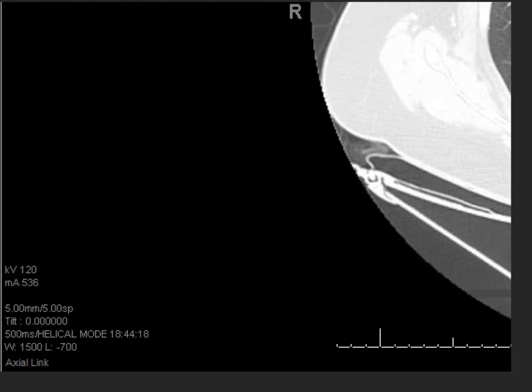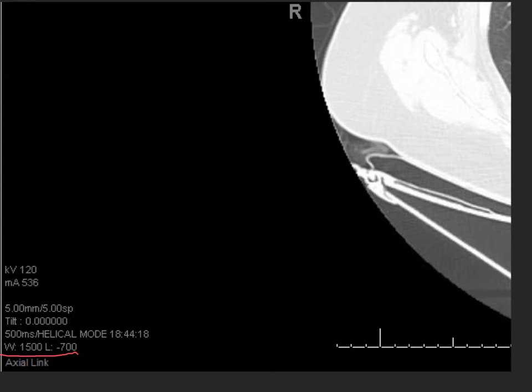Now I'll describe what I mean by a window and a level. Where can we find this information? If you look at the corner of any CT image, you will see a little W and an L. This particular CT scan has a window of 1500 and a level of minus 700. Any tissue window is a combination of these two values — a window and a level — and they vary depending on the display window.